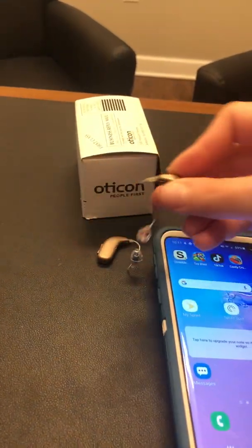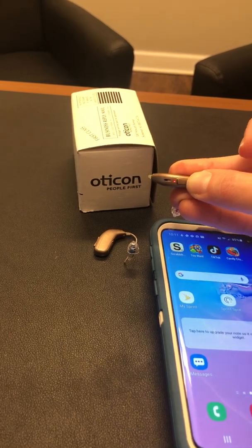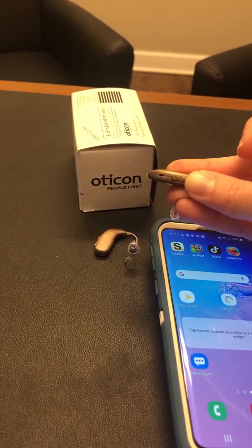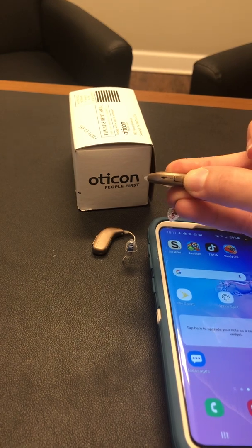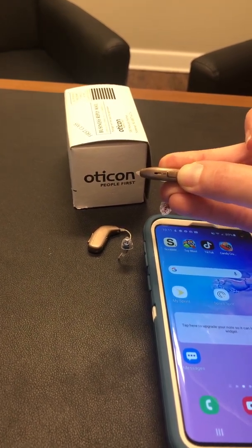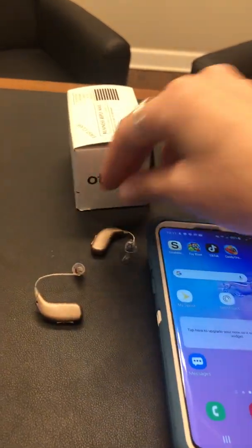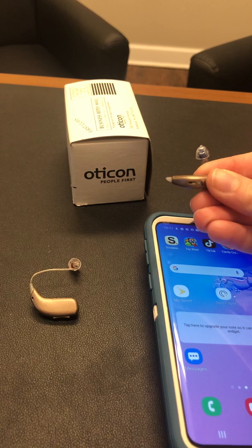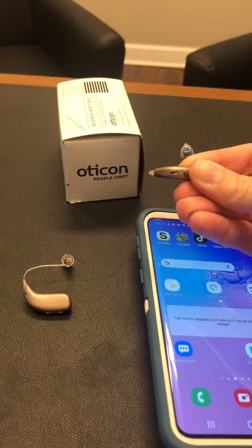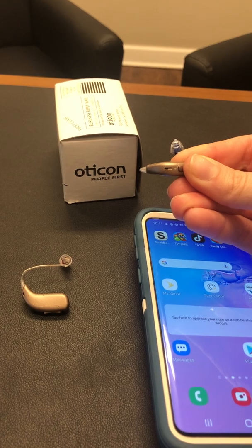To get the hearing aids in pairing mode, you have to turn them off by holding the bottom button down for three seconds until you see the red light, then turn them back on for three seconds and you will see a green light. You want to do that with both devices so that they are now in pairing mode.